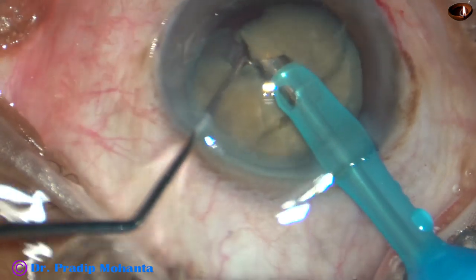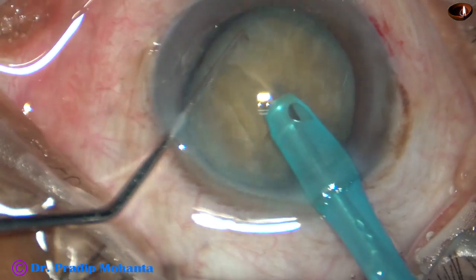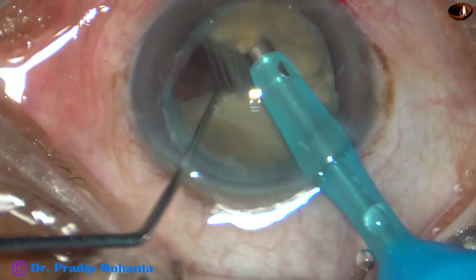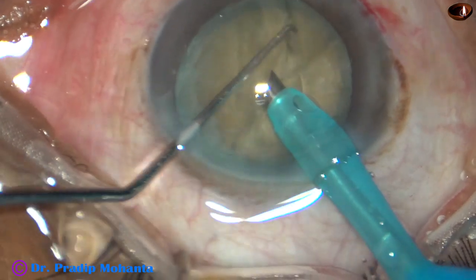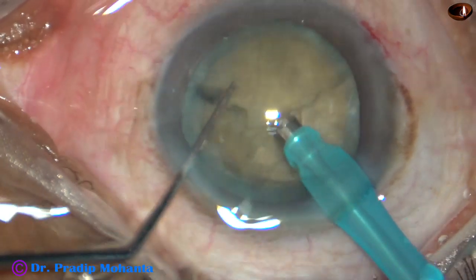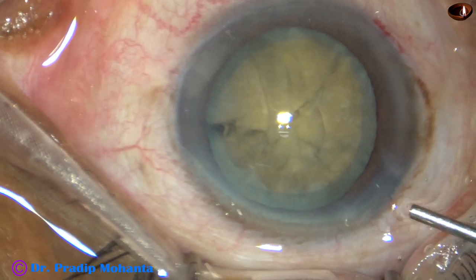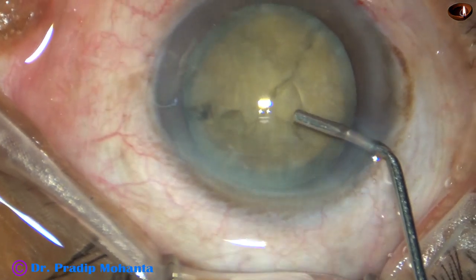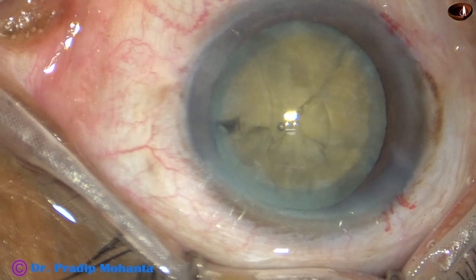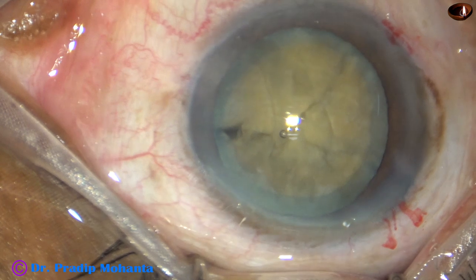This is another crack, but no nuclear fragment is free. You can see the leathery fibers joining the fragments. Now I injected viscoelastic — 2% HPMC — and asked for two instruments, two Osinski hooks, to manually try to separate the pieces.